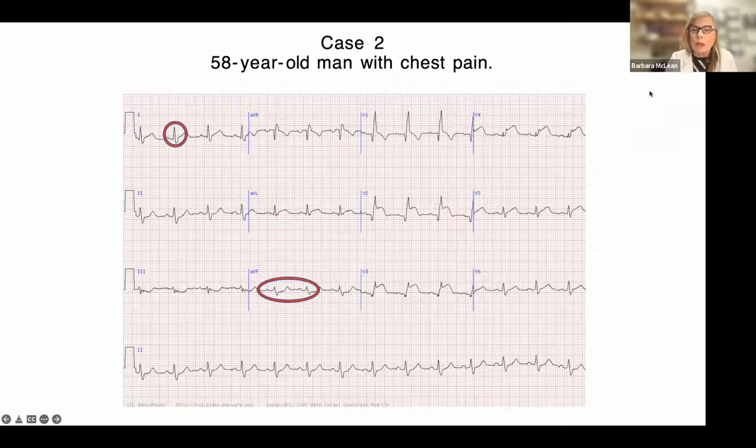And then we go over to the chest leads and we say, uh-oh, big R wave in V1, upright is bigger than downwards. That's the zone of transition. Whenever you have an early zone of transition, meaning more upright than downwards, in V1 or V2, first thing you got to do is say, how wide is this? And it is 1, 2, 3 boxes, meeting criteria of 0.12. Anything greater than 0.11 indicates that you have a depolarization deficit.